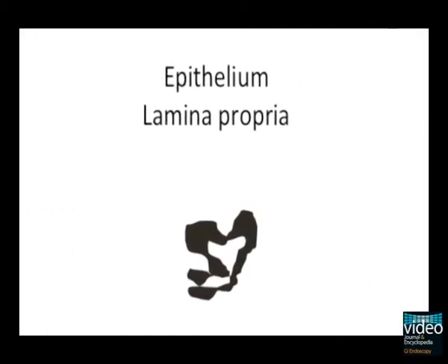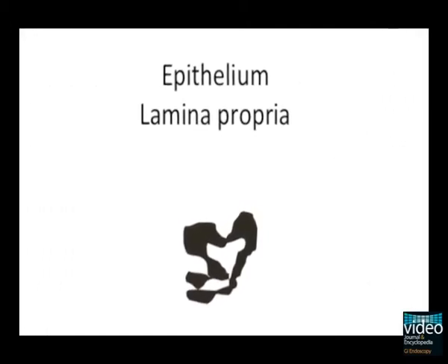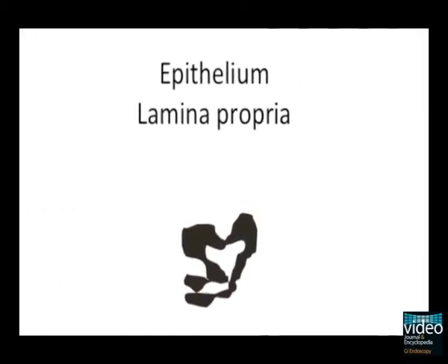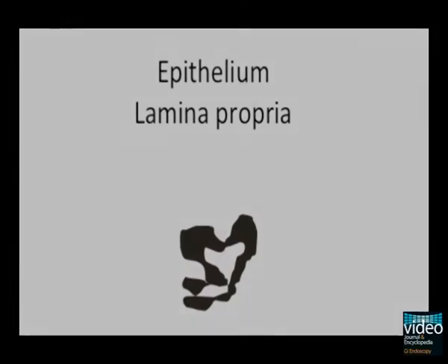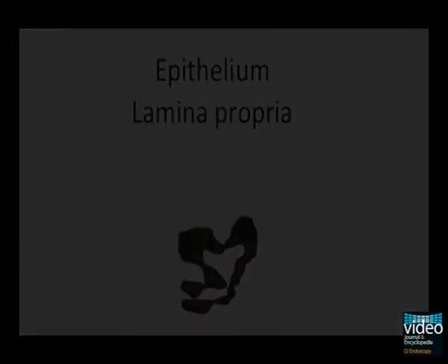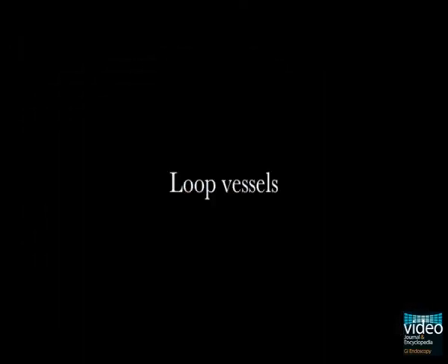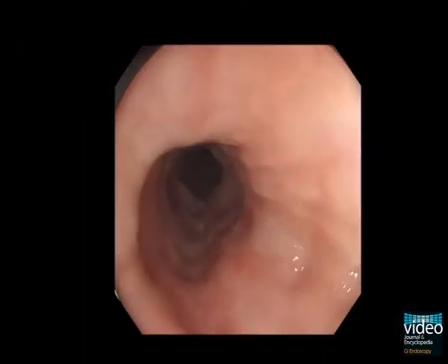The first case demonstrates dot-like loop vessels typical of high-grade intraepithelial neoplasia, cancers limited to the epithelium and the lamina propria.